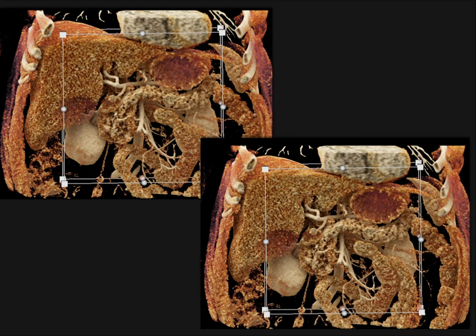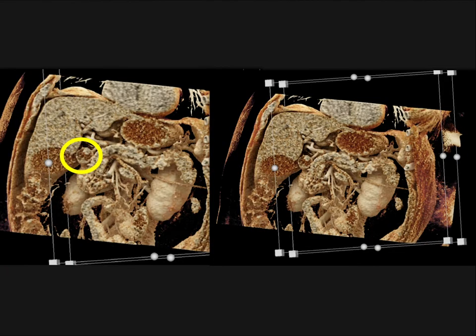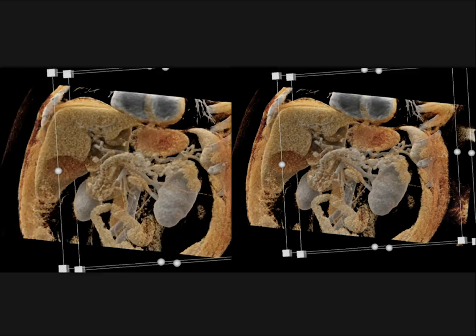It's interesting, the lesion almost has the texture of the pancreas because of its vascularity. But again, here's a range of different views. And I put a lot of images in this case of each individual example to really give you a feel of how the lesions look. And this is a very common appearance. I saw 1 or 2 in the last 2 weeks. Both of them were missed on the initial read. Both of them were missed on the outside CT scans. And again, you can move forward when you see this information. And here it is again, very nicely seen.